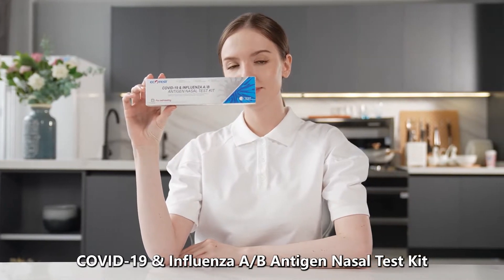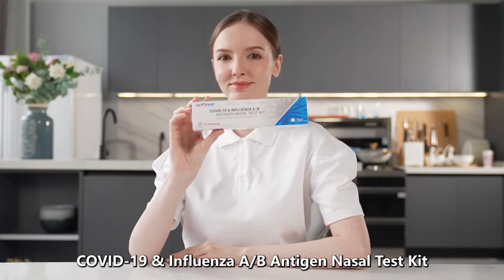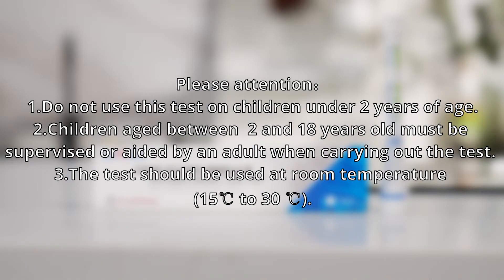COVID-19 and Influenza A-B Antigen Nasal Test Kit. Please pay attention. 1. Do not use this test on children under two years of age. 2. Children aged between 2 and 18 years old must be supervised or aided by an adult when carrying out the test. 3. The test should be used at room temperature, 15 degrees Celsius to 30 degrees Celsius.